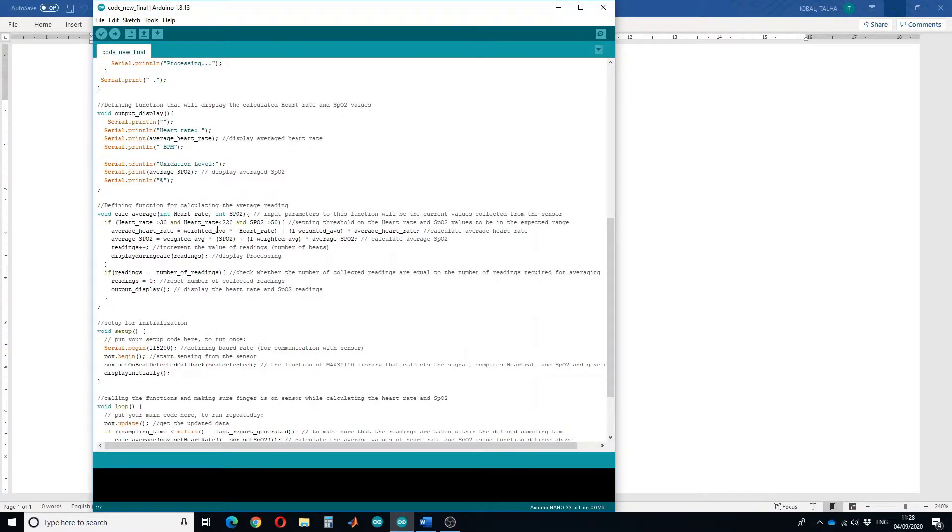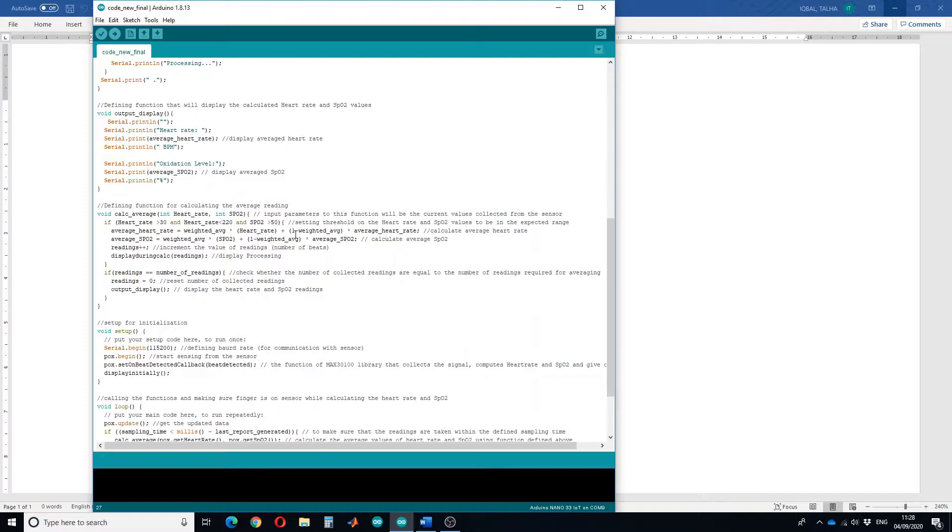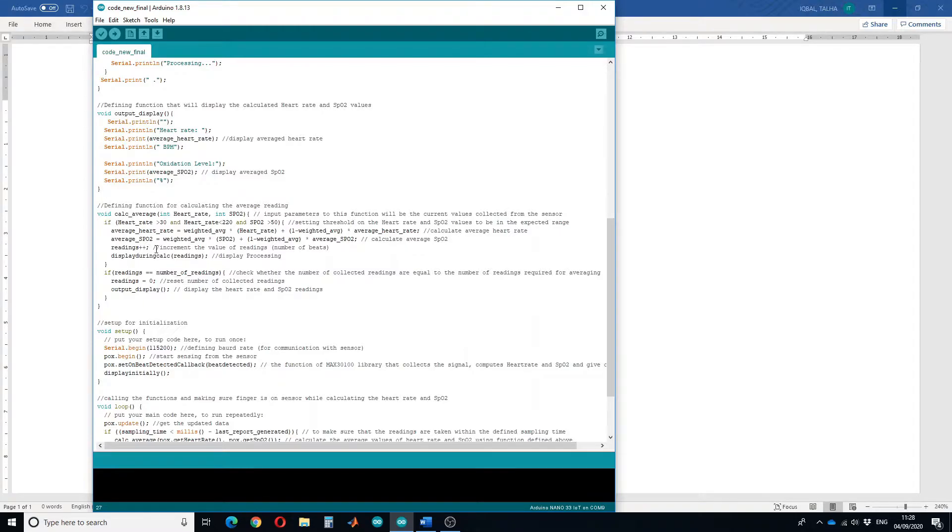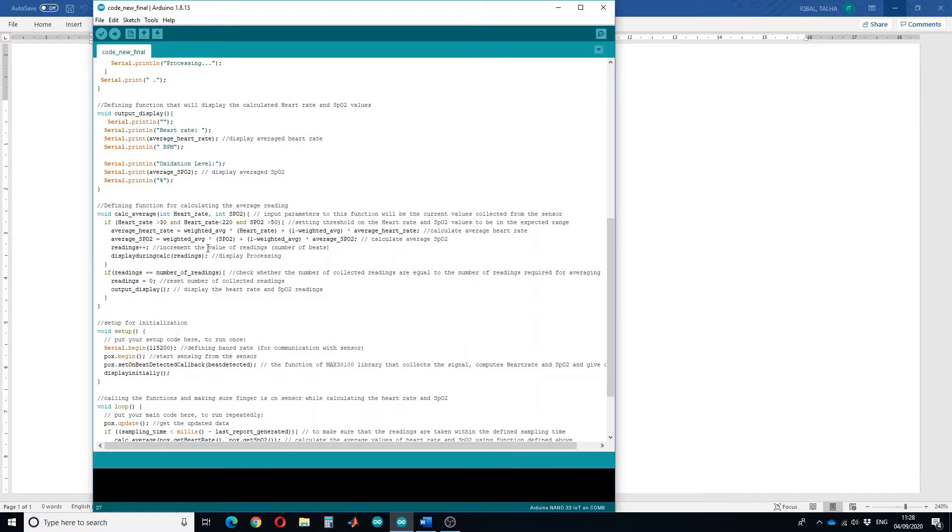This line of code will average the heart rate value and this line of code will average the SPO2 value. We will increment the reading so that it knows how many number of beats we have already calculated. When the number of readings is equal to the number of readings we want to average, then it will terminate this loop and will display the output.